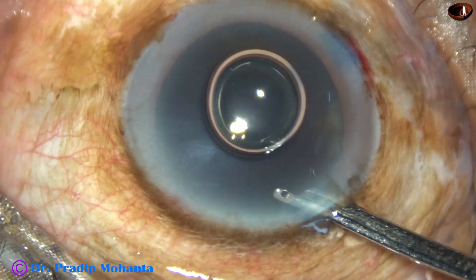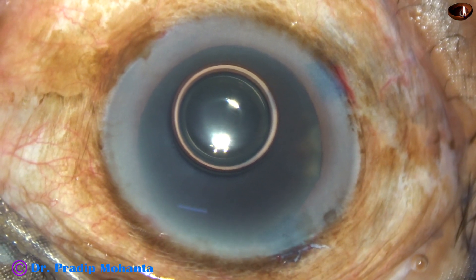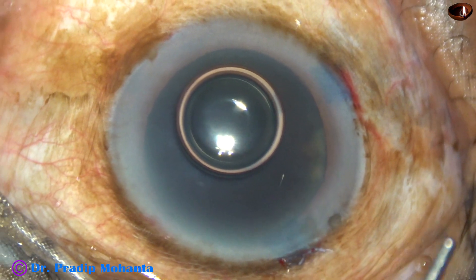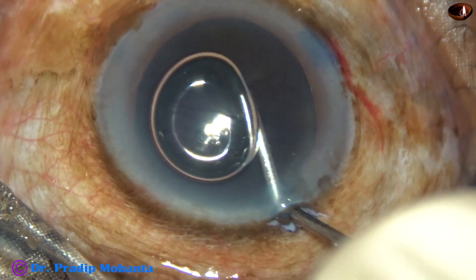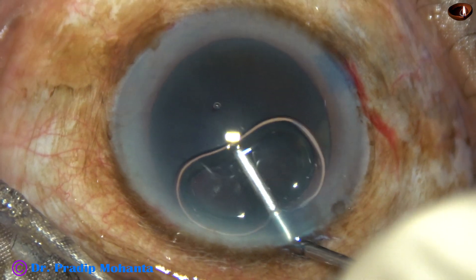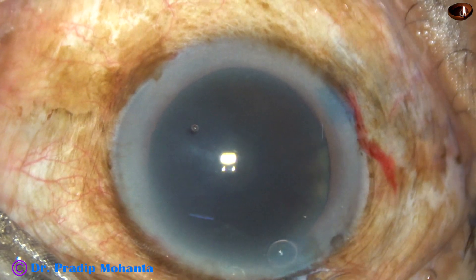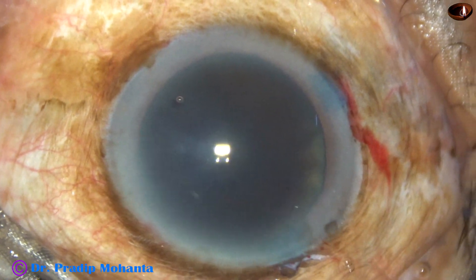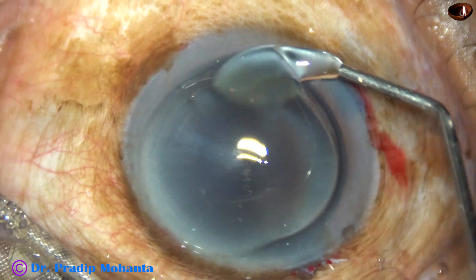And in this case, I am going to use 2% hydroxypropyl methyl cellulose as the viscoelastic substance. The viscoelastic has been applied nicely. And now, I apply the visco over the cornea, and this will improve visibility.